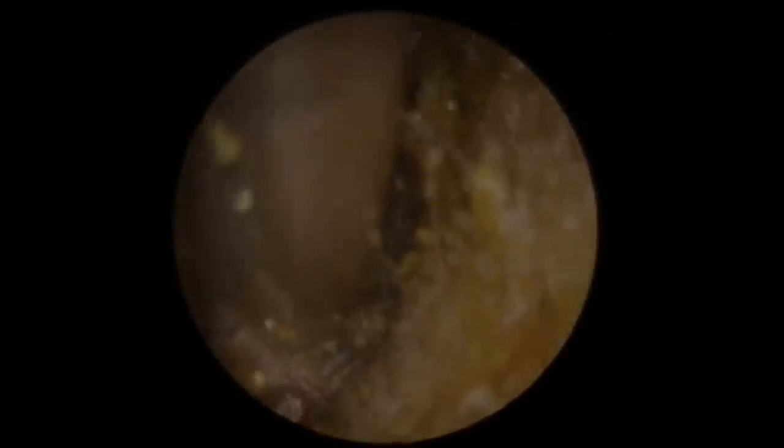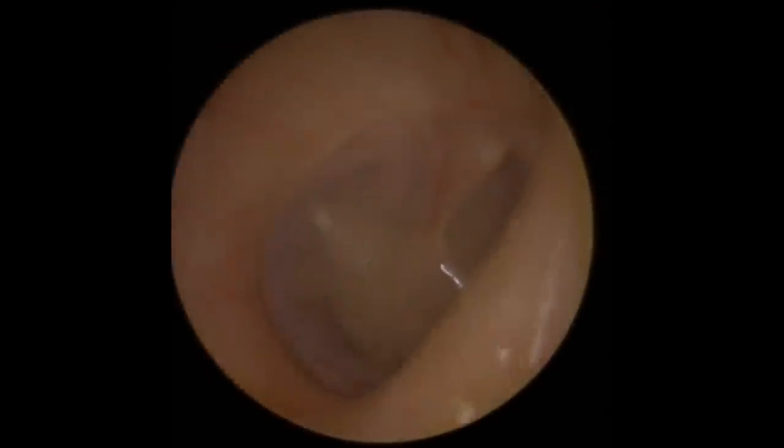Just trying to peel away from that canal wall. Aiming for that smooth section again, now trying to find a flatter surface to get a better suction grip. Just lifting from the bottom, trying to lift up into the centre of the canal to detach it — you can see it starting to fold forwards. Take that little bit away, just get rid of some of these looser bits of dry flakes of skin on the outside. We can see the eardrum there — there's the eardrum.